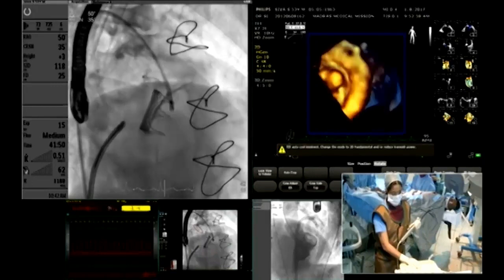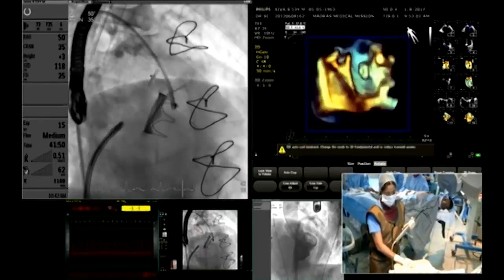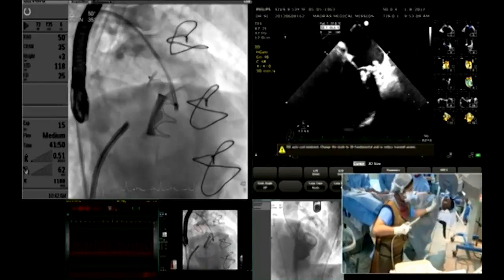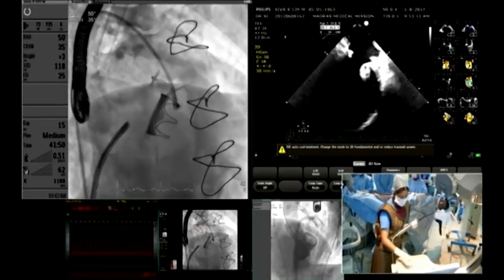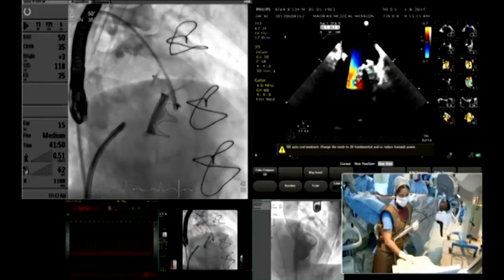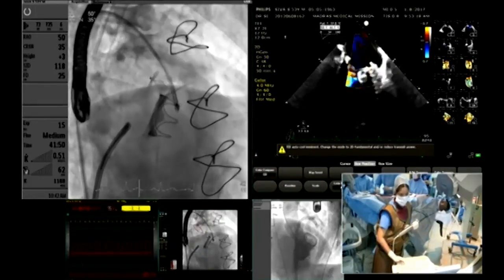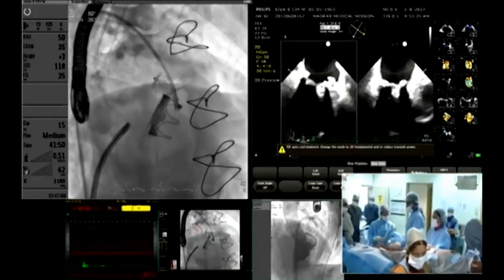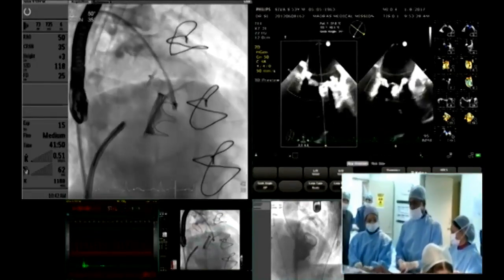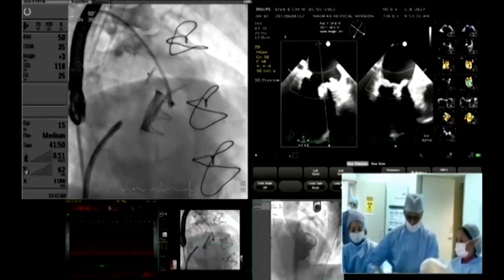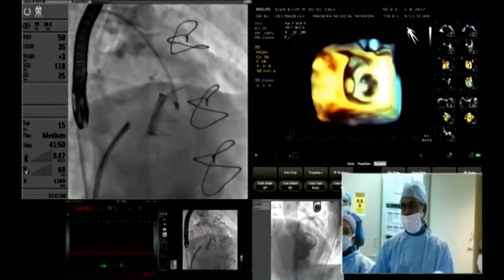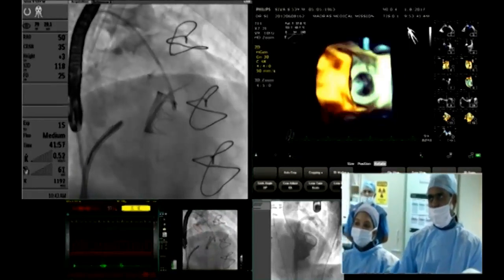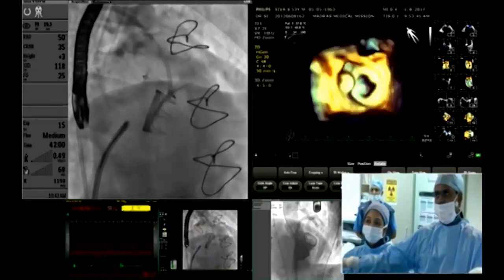That is the ventricular disc on the ventricle. Now open the whole valve and show all three leaflets. This is good — now put the color on the mitral valve. This looks to be a perfect position. The advantage of this is that the echocardiogram has primarily guided a lot of this. Without wasting much time I am releasing, because the longer you hold with a cable, the cable will tend to pull out the device since the device does not have inherently good strength — it is a very soft device and just tends to collapse. So now I have released it.